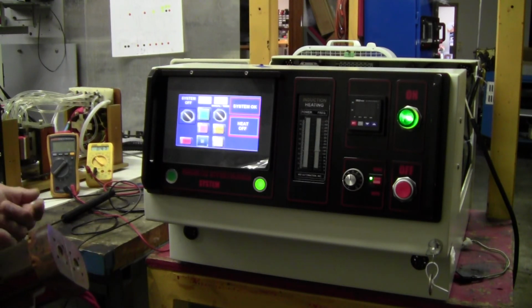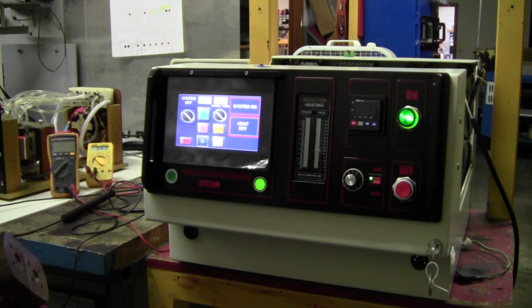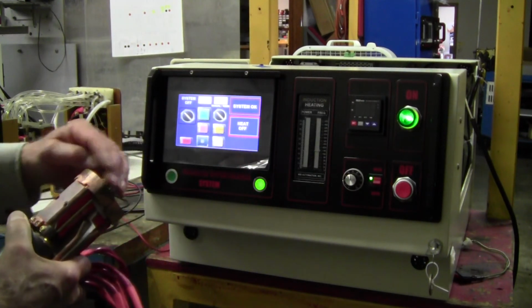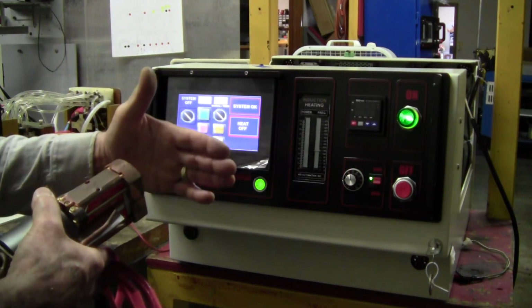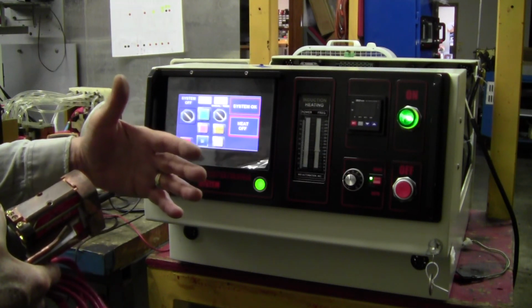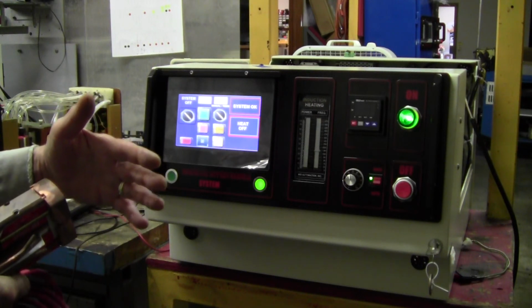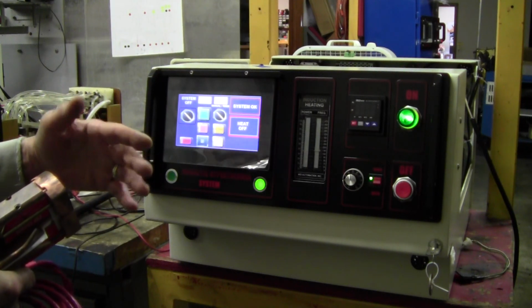But there's a lot of cancer. And the cancer needs to be treated in humans. So you can't put humans in a round heating coil. You can barely put an arm or a leg in a heating coil. So the idea of this, with a proper coil, is you can apply the energy directly to the surface of the person. Like breast cancer, for example, which would be the most obvious. You could apply the heating directly to the surface. Not with a round coil, per se. It would be with a flat coil. They're called planar coils. So that is something that could be an option to this machine.